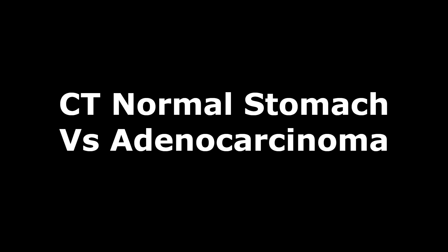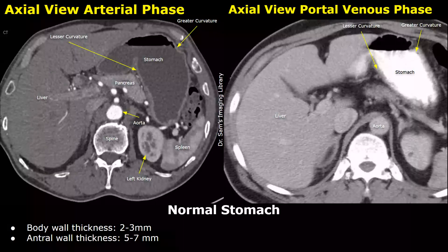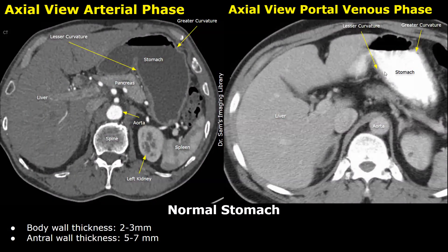Hello everyone, this is Dr. Sam and today we will learn about the CT imaging of gastric adenocarcinoma. First, we will look at the normal stomach CT appearances. These are axial views. On the left, we have the stomach appearing well distended with water, displaying a smooth inner surface.